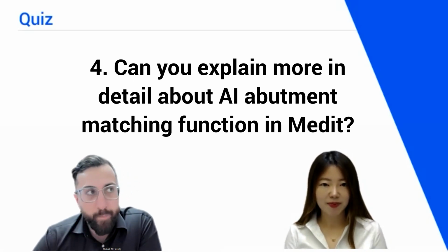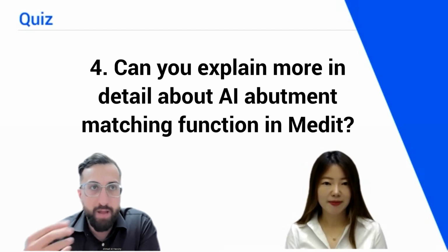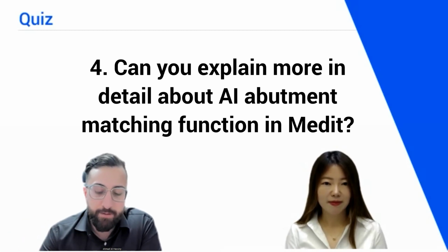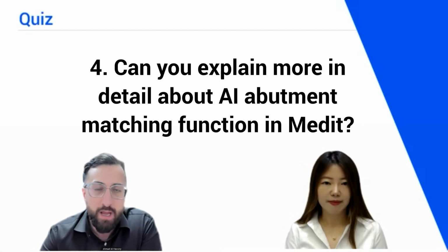Of course. So the AI abutment matching feature is a feature in the Medit software where, let's say you have an implant that you want to restore. Typically, you're going to screw in a scan body. I know some people still do abutment level scans and scan an abutment, but most of us are using scan bodies.